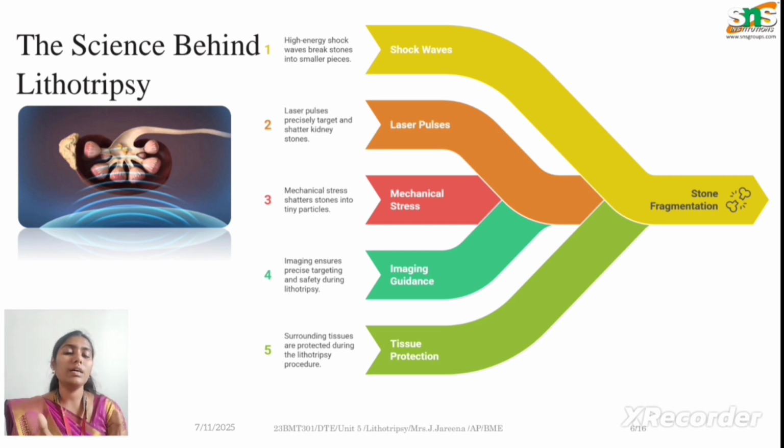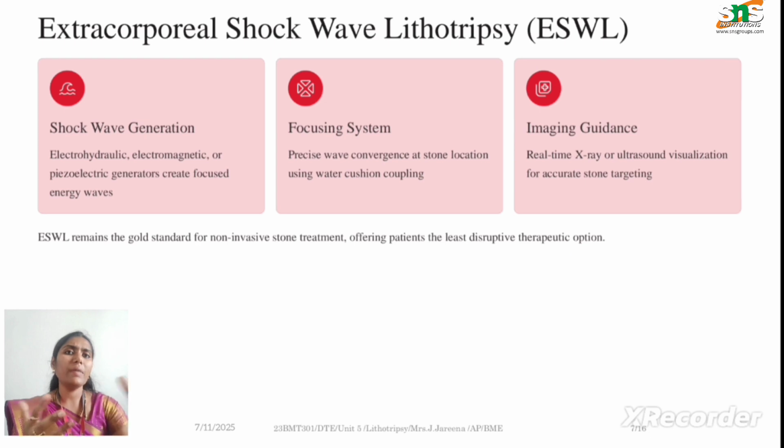For this technique they are using the water coupling method. And also for passing the energy, they have different types. In some cases they are using shockwave. In that they may be using electrohydraulic, electromagnetic or piezoelectric to generate this sort of energy.